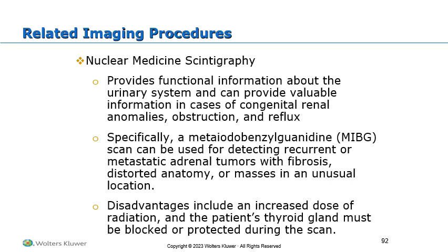Okay, that brings us to nuclear medicine, which isn't exceptionally expensive, but it's usually less accessible. It does provide excellent functional information, although the image is not always pretty. They tell us excellent functional information about the urinary tract, which can be useful in our young population.